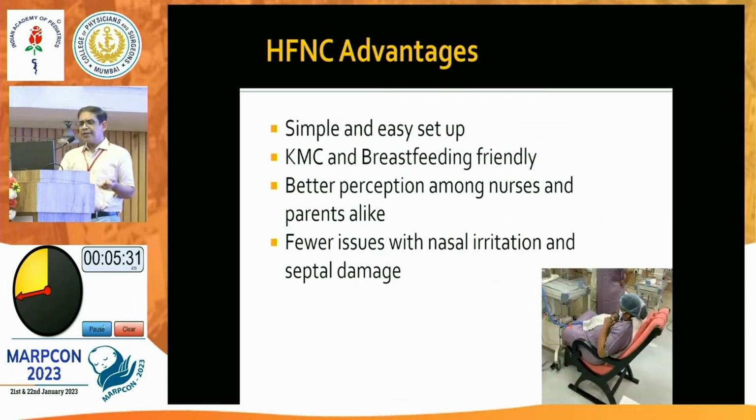What are the advantages? Simple and easy setup, very friendly while giving kangaroo mother care. Nurses and parents feel that it is very comfortable for themselves and babies to handle, and there are fewer issues with nasal irritation and septal damage compared to CPAP.